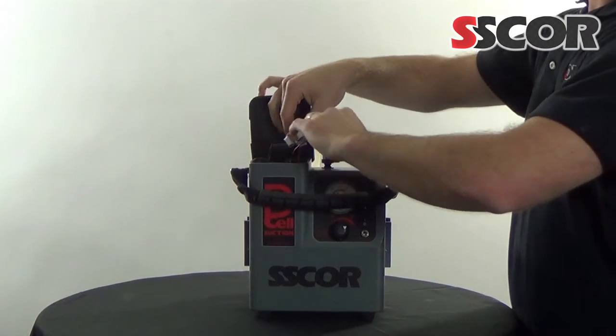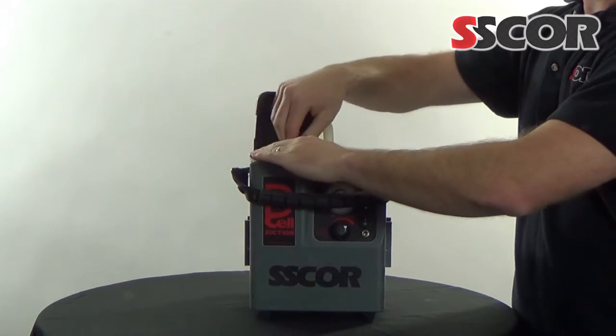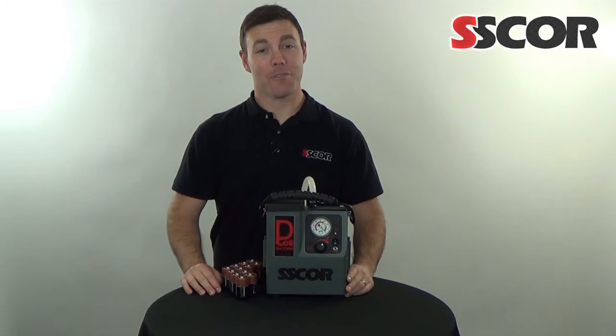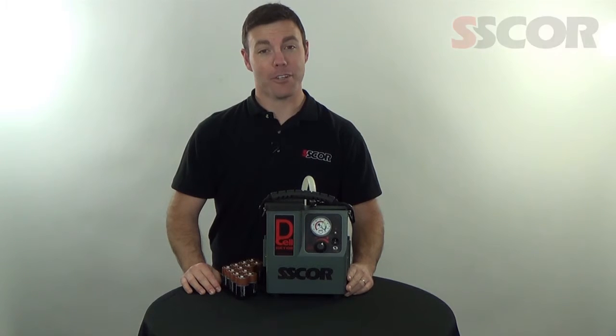As noted earlier, the battery holder only fits in one orientation. Reconnect the Molex on the battery holder assembly to the wiring harness. Turn the device on to verify the batteries are correctly installed and the battery holder is connected to the wiring harness. Once the device is running from the internal battery pack, check the control panel and observe the battery voltage indicator to gauge the level of battery charge.